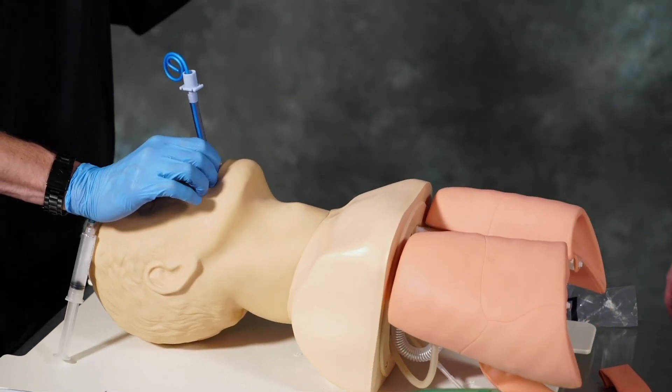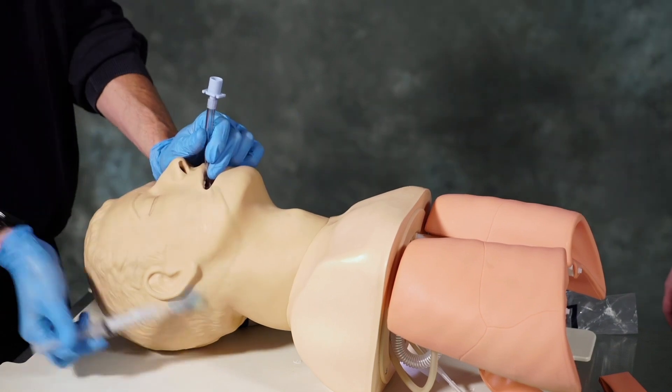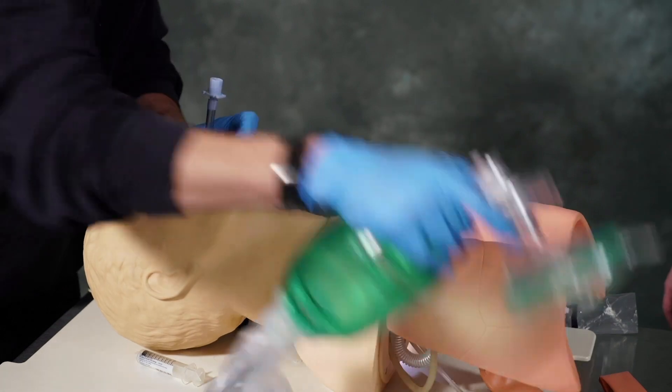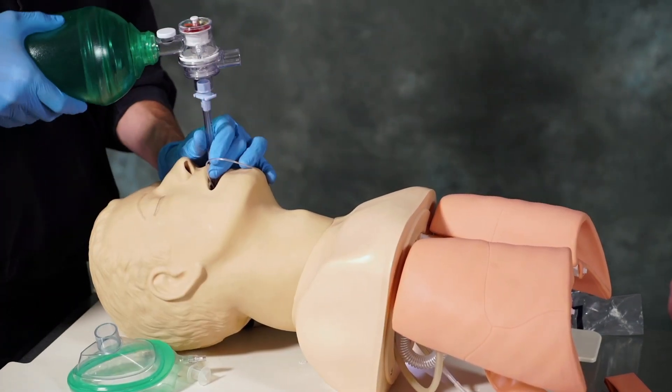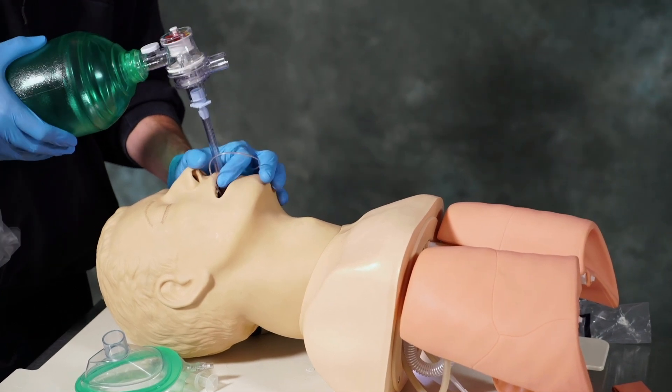Once we have it in place, we remove the blade, pull the stylet, and inflate the cuff with 10cc's of air. Once we have that completed, we want to make sure that the BVM is flowing well and that we have good chest rise, ensuring that the tube is in proper position.